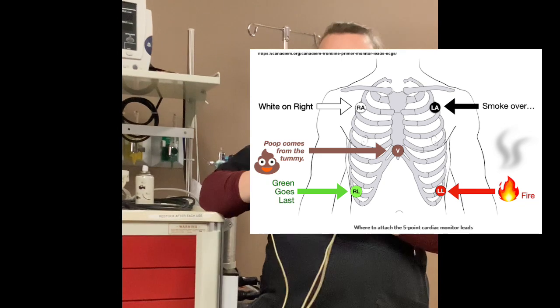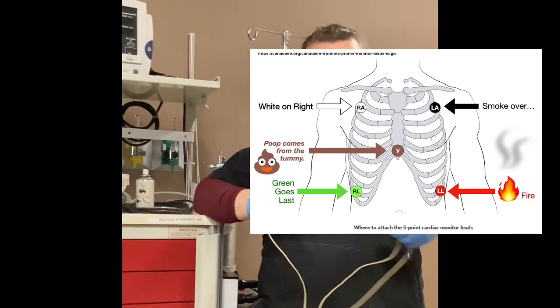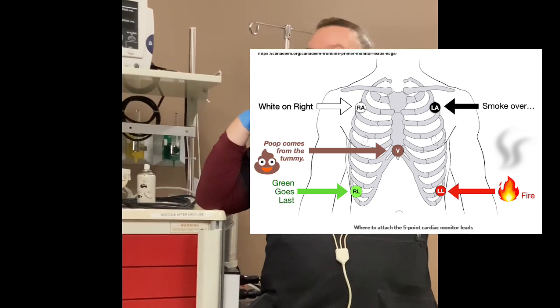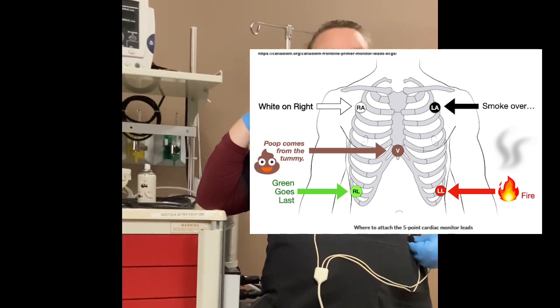So this is here, and the red's down here. That's how everybody remembers it: white to the right, smoke over fire, gray or black over red, which goes down here.